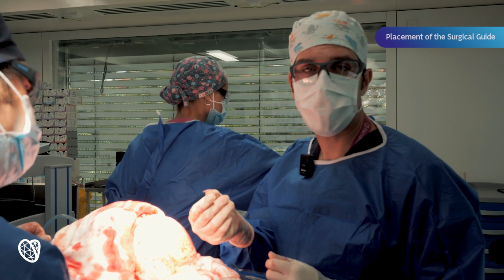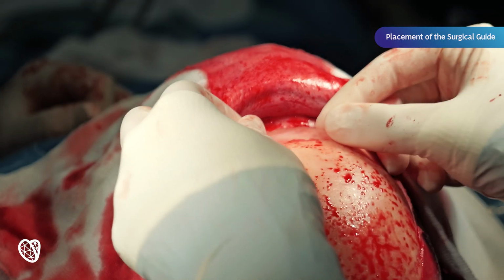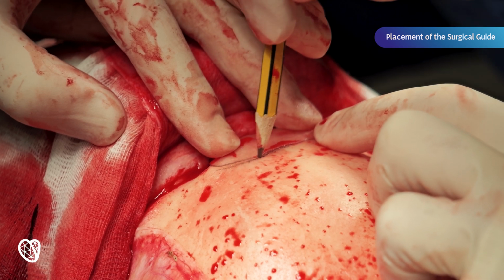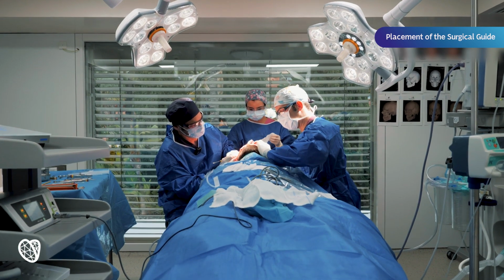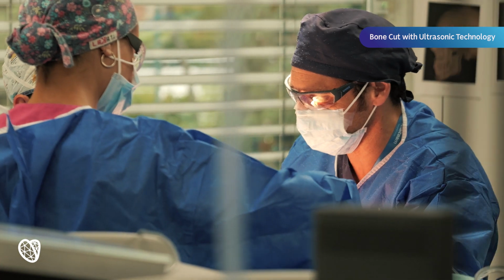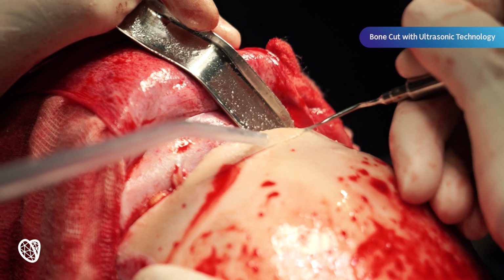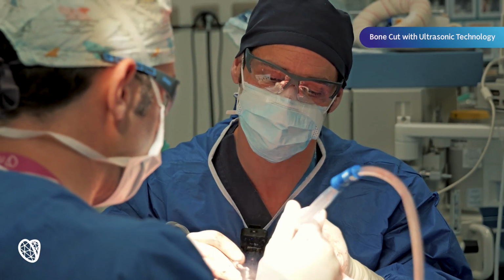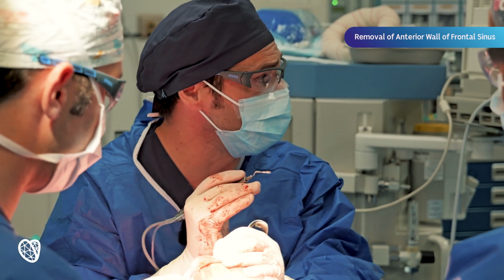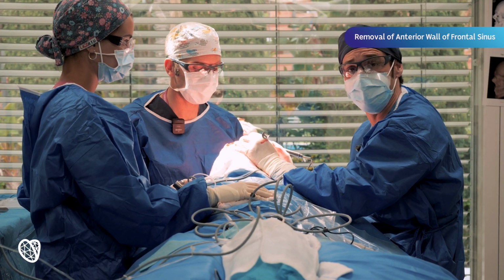This is the surgical guide that we generated before the surgery, okay? We use it to do the osteotomy. Now that we have completed the bone cut, the osteotomy, with the piezo surgery, we are going to take out the anterior wall of the frontal sinus.